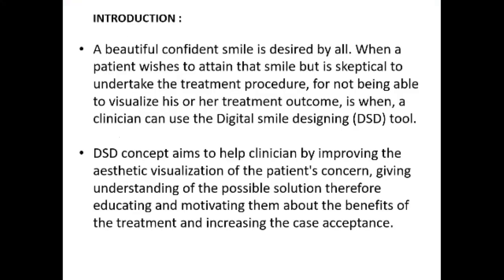Coming to the introduction, a beautiful confident smile is desired by all. When a patient wishes to attain the smile but is skeptical to undertake the treatment procedure for not being able to visualize his or her treatment outcome, that is when a clinician can use the digital smile design tool. Whenever a patient walks into a clinic, the patient is not confident about the final outcome of the treatment. So a digital smile design can help the patient visualize what could be the end result.